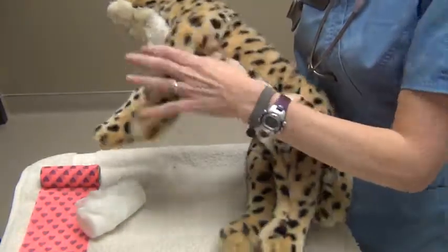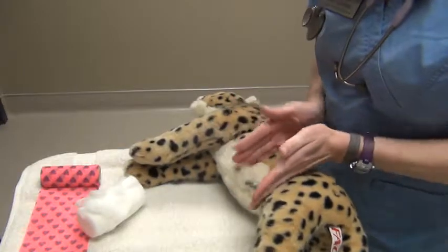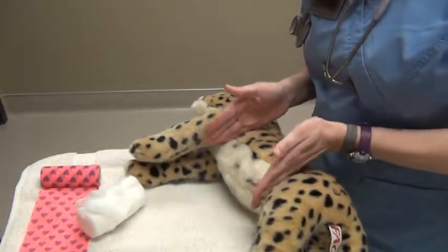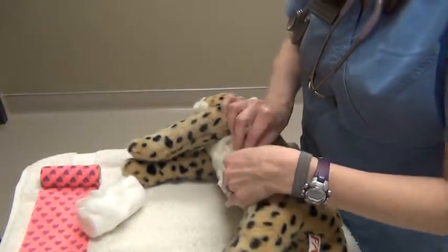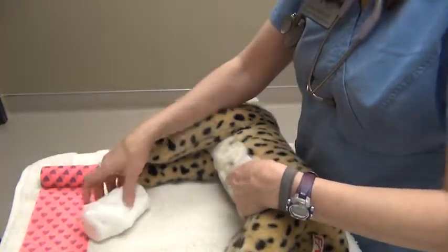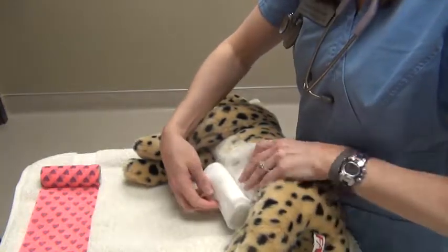We're going to keep this bandage really simple. When we do an abdominal bandage, we're just going to wrap, obviously, the abdomen. Sometimes people will go up onto the chest, but we're just going to do abdomen. So I'm going to go and apply my first layer. We're going to pretend that she has a wound with this bandage. So you're going to apply the primary layer, which is the Telfa, to keep anything from sticking.